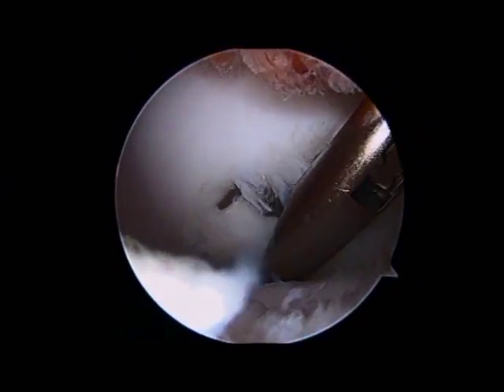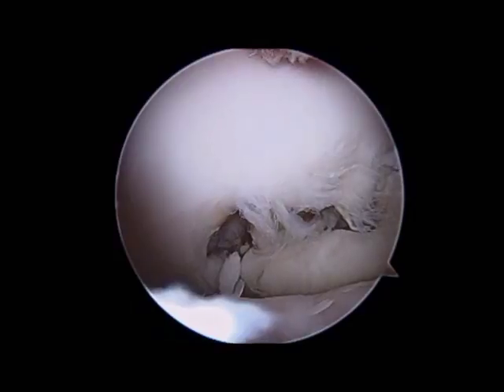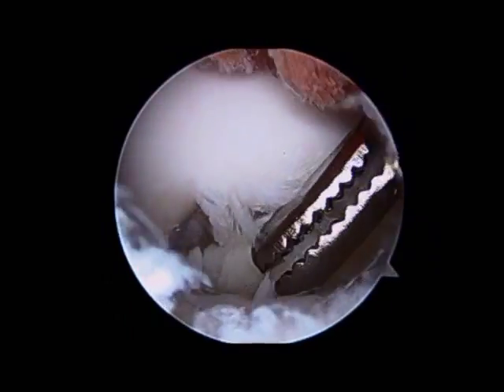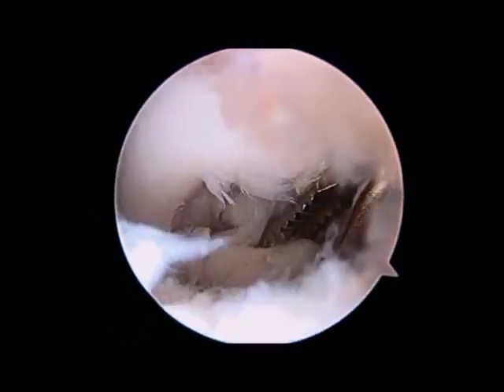A grasper is brought in to remove these pieces so that they do not separate and float around the joint. The problem with these pieces of cartilage is that they have very thin underlying bone, very poor blood supply, and therefore very poor healing potential.